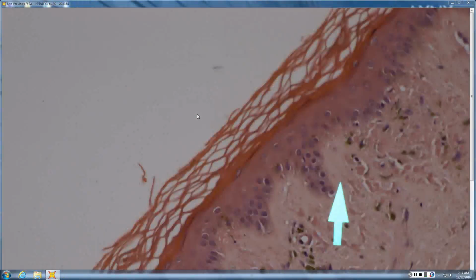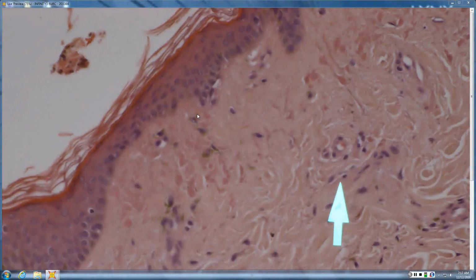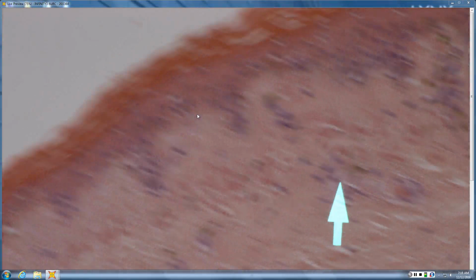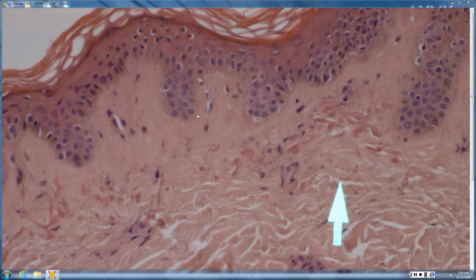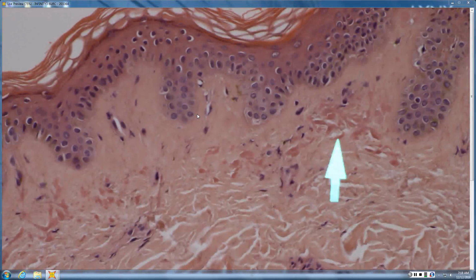They probably have both. Don't worry about it. I mean, they're diabetic. They've got early itching, and there's some macular amyloid because they're itchy because they're diabetic. It's fine. They're both on the differential. It's very sparse, and if you aren't looking for it or aren't paying attention on higher power, you could completely miss all of this.